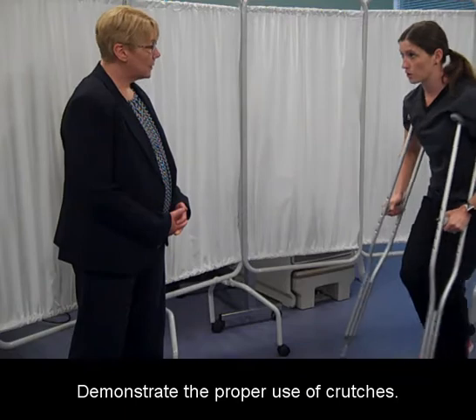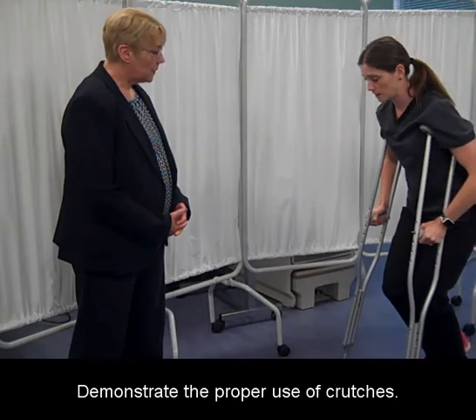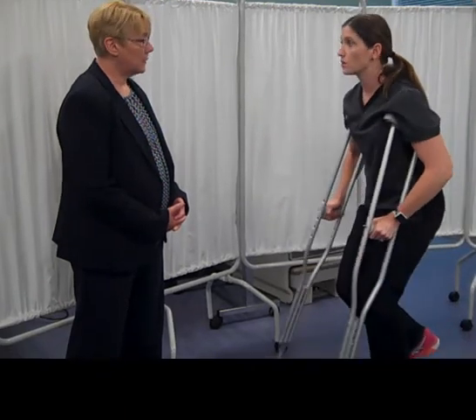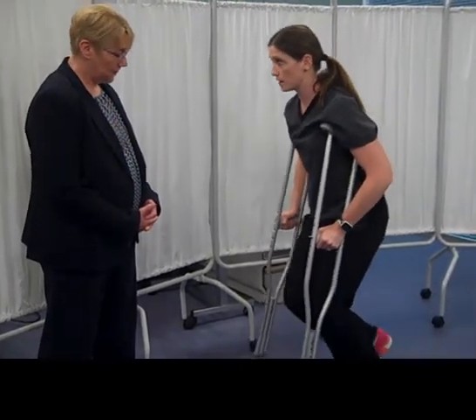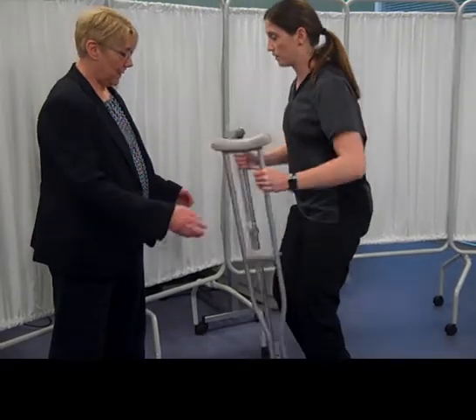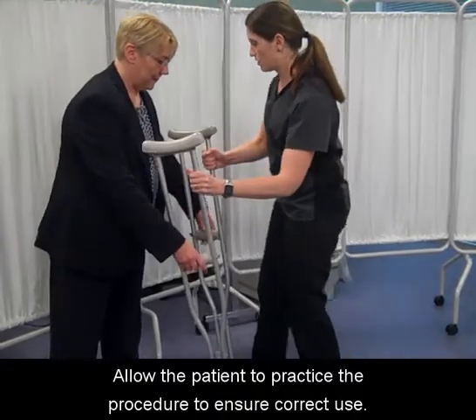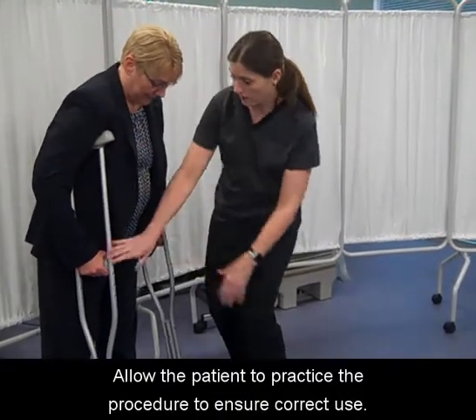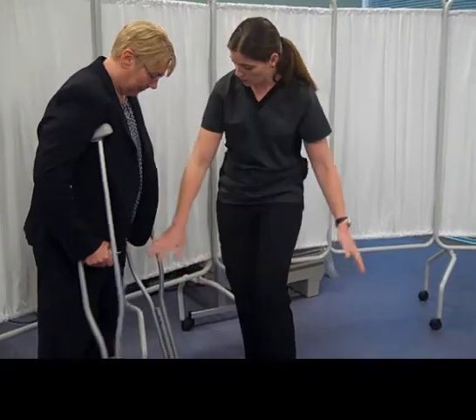Demonstrate the proper use of crutches. Allow the patient to practice the procedure to ensure correct use.